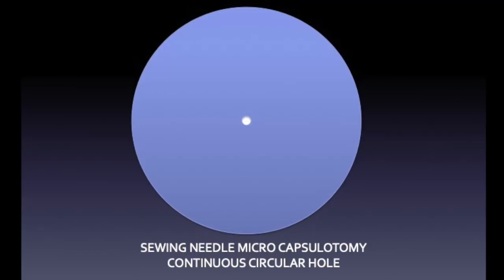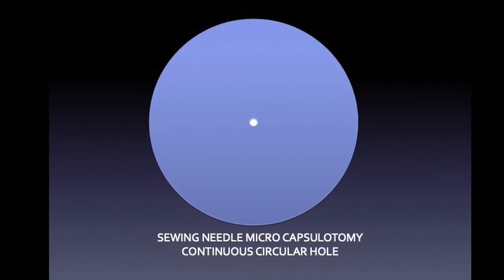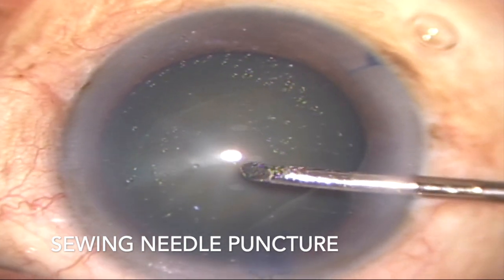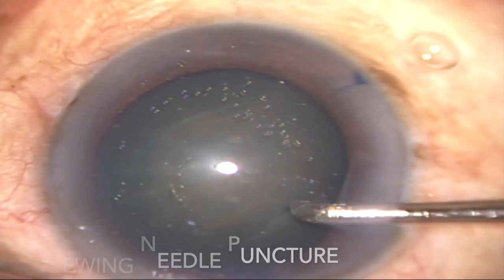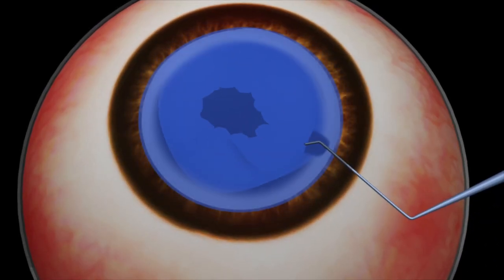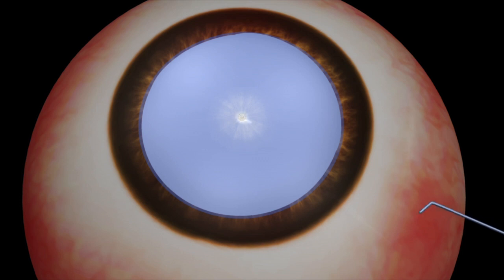Unlike the slit produced by the hypodermic needle, the round pointed tip of the Sewing Needle Microcapsulotome, when piercing the tight and stretched anterior capsule, creates a hole. This hole is similar to a mini capsular rhexis with a round, continuous circular edge without any discontinuity. The round hole created by the microcapsulotome does not tear away with the sudden outburst of intralenticular fluid and disruptive force generated by the high intralenticular pressure. Simultaneous evacuation of liquefied cortical material through the hole decompresses the capsular bag and allows the intralenticular pressure to equilibrate prior to the creation of the capsular rhexis.